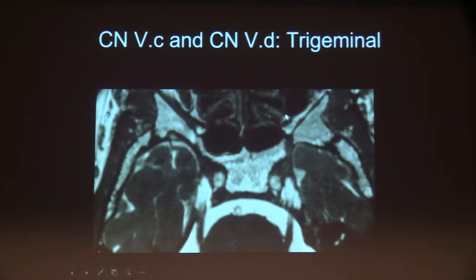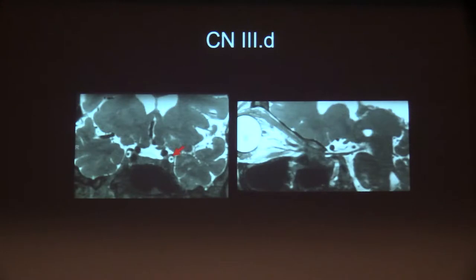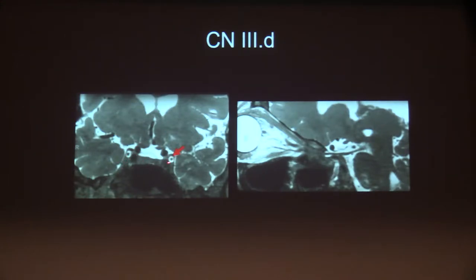The most famous dural cave segment is that of the fifth cranial nerve — Meckel's cave — where the fifth nerve comes into proximity to but does not yet pass through the dura. Each cranial nerve has to go through that transition and has a dural cave, often small. Here in the coronal view on a pre-contrast CISS image, you can see the oculomotor nerve in a small dural cave surrounded by cerebral spinal fluid, and the same thing in the sagittal reconstruction.